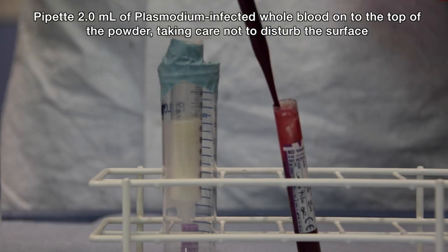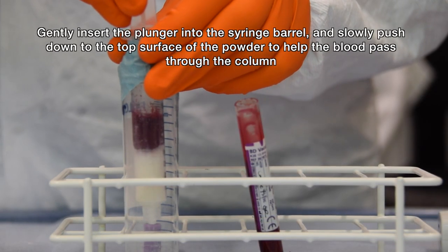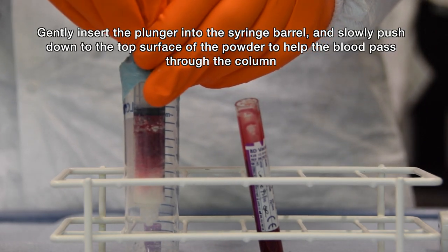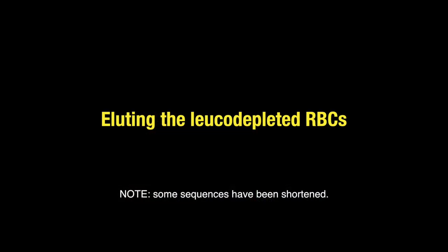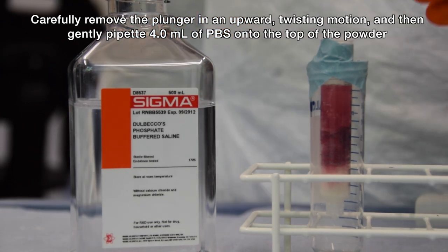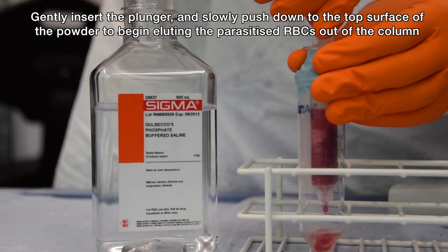Pipette 2ml of Plasmodium infected blood onto the top of the powder, taking care not to disturb the top surface. Gently insert the plunger into the syringe barrel and slowly push down to the top surface of the powder — this will help the blood pass through the column. Carefully remove the plunger in a gentle upward twisting motion. Pipette another 4ml of PBS onto the top of the powder, taking care not to disturb the surface. Gently insert the plunger and slowly push it down to the top surface of the powder to begin eluting the parasitized red blood cells out of the column.